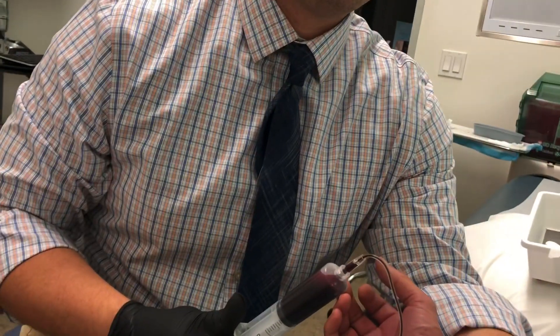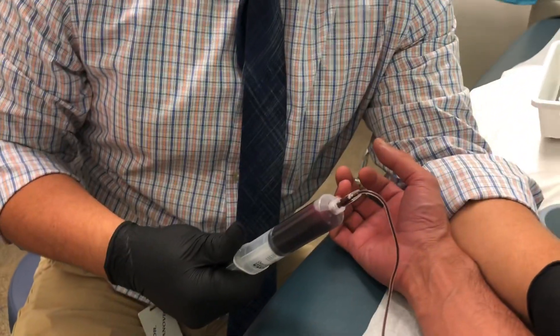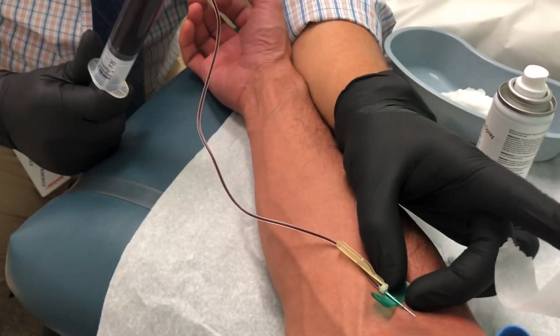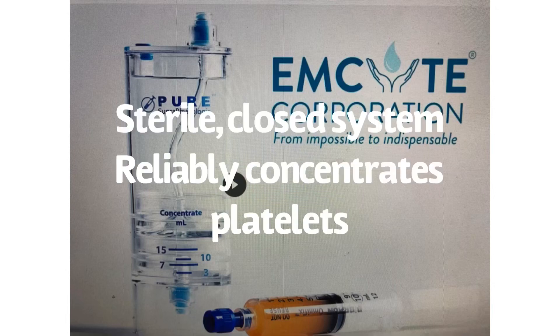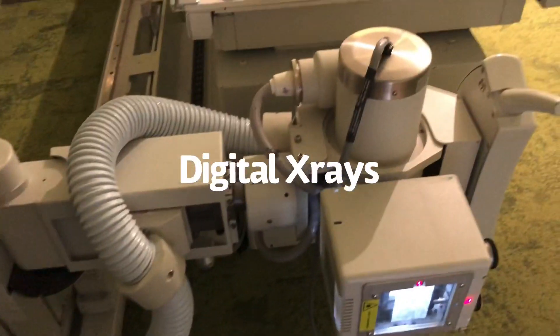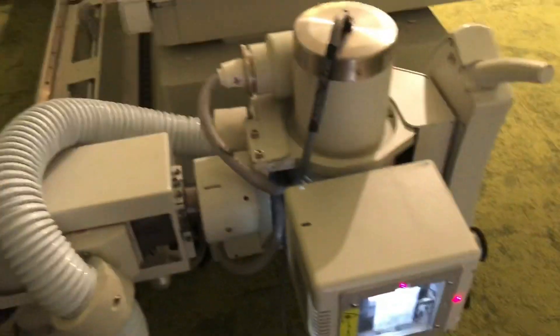It's probably because I work out pretty hard, or maybe it's just genetics. Anyway, here we go. This is step number one. I'm going to take you guys through this whole process with me being the guinea pig model for my injection. I'm getting some new x-rays here at Restore — we have a digital x-ray system. Doing a lateral view right here, getting my x-rays done.